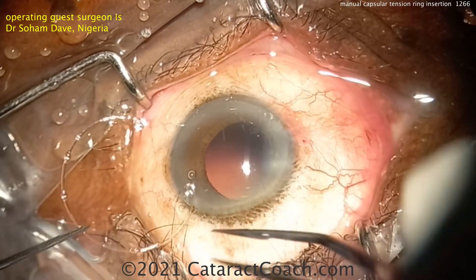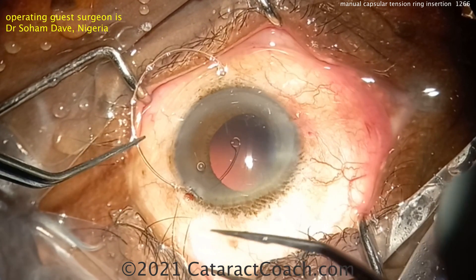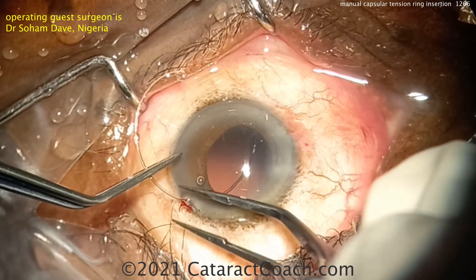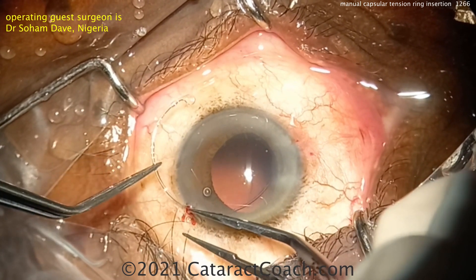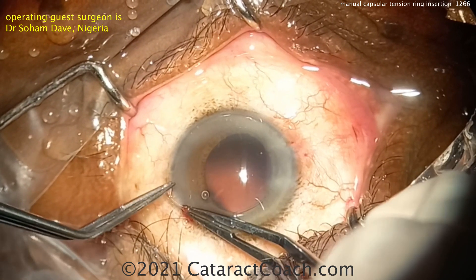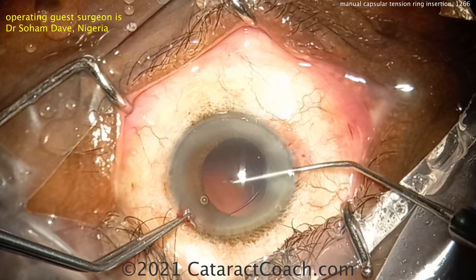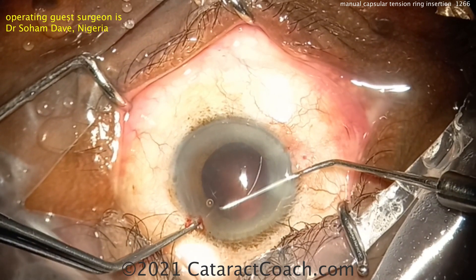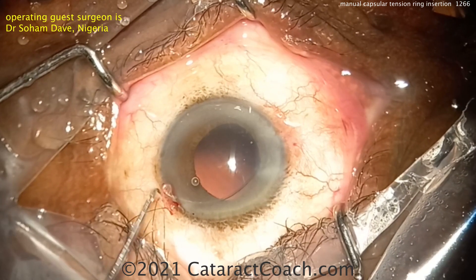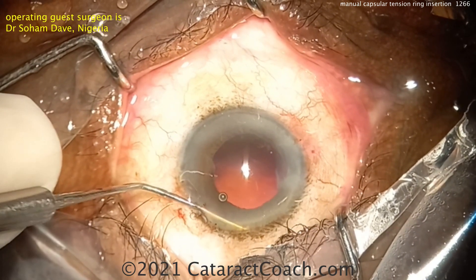When you put it in the capsular bag, it'll push towards the edges. You can go through your paracentesis and just dial it in as you push it into the eye — you want it to follow the curvature of the capsular bag. You can also use a Sinskey hook through another incision to hold that leading eyelet, which is sometimes very helpful. He's passing it around nicely, going along with the curve.